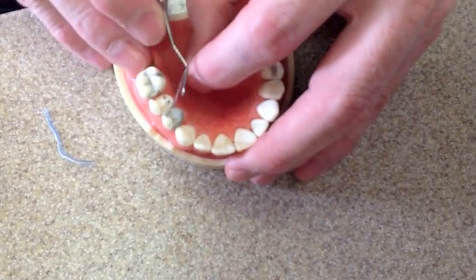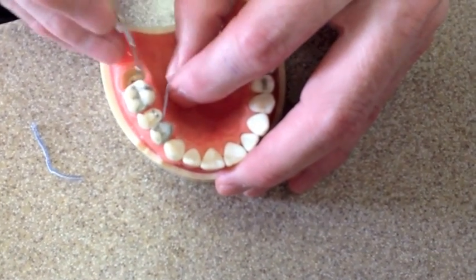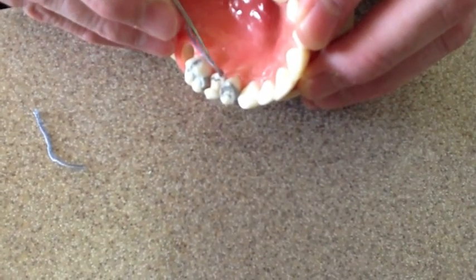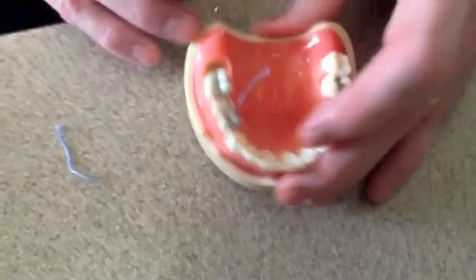And I can actually pull it tight and wrap it around and just go to the back and push it there, and it usually falls in. Okay, so now I can kind of push it in. Okay, we're in there. Okay, so come on the back. Now we're on the back.